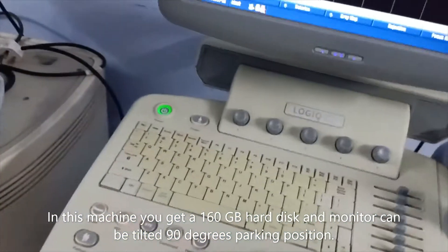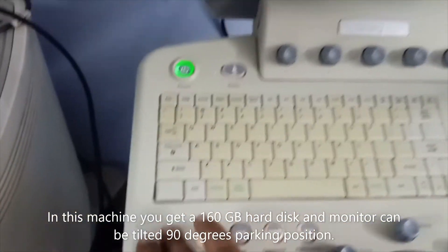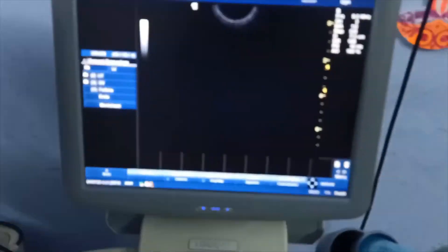With this software you get DICOM 3.0 connectivity, Logic View, full switch USB, and ECG support.